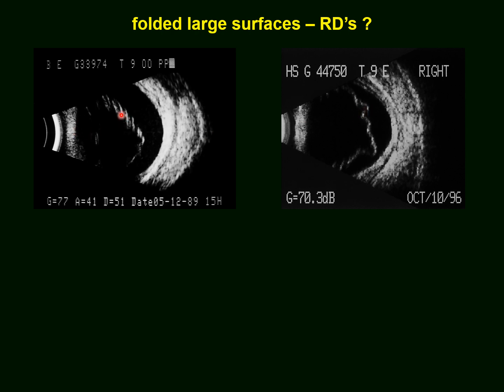Here even so strong that the beam width causes lines of these points, and in between where the beam hits this surface that is very smooth obliquely we get total reflection and thus shadows. We see the shadows here too.